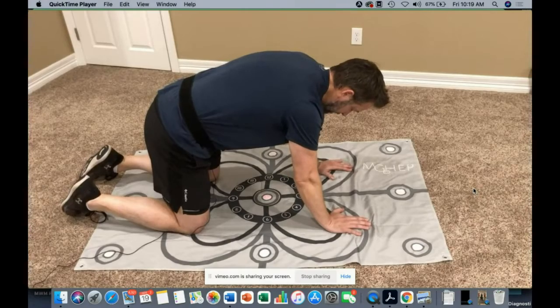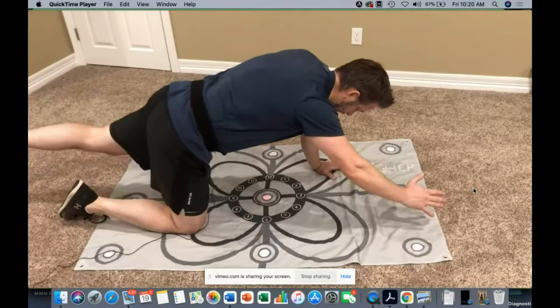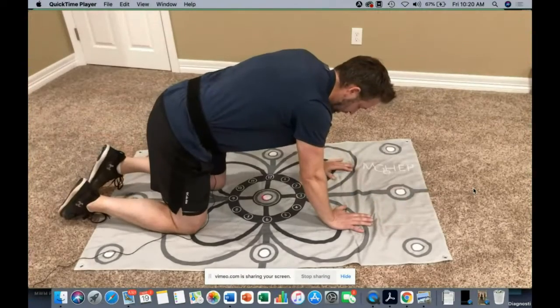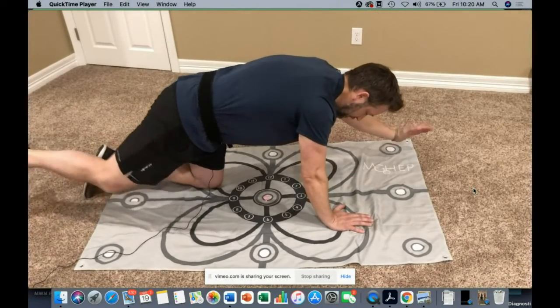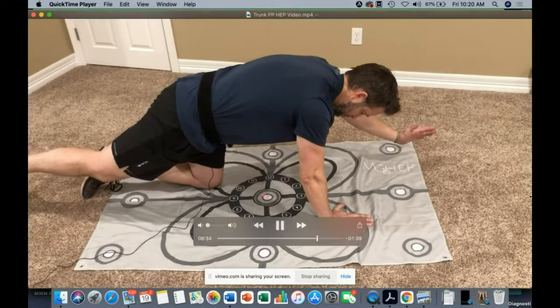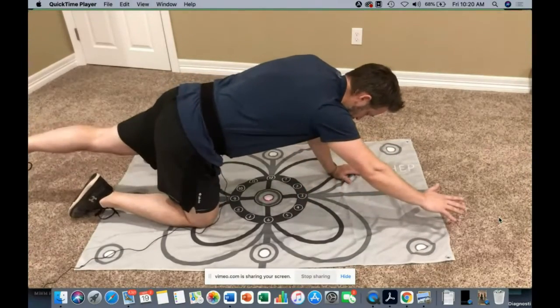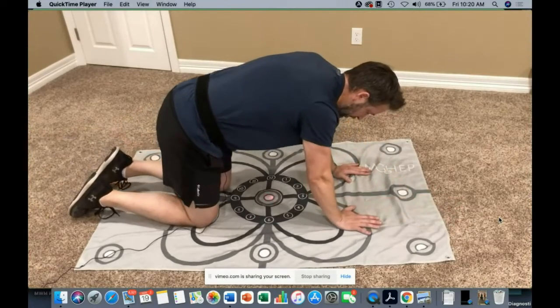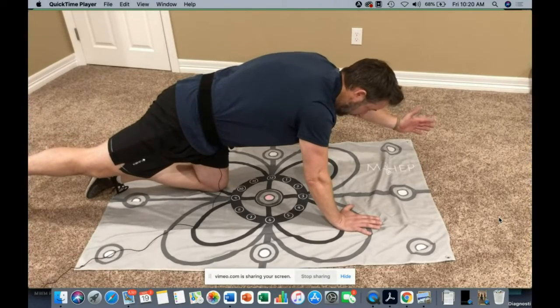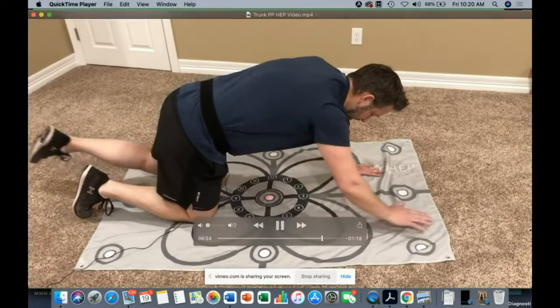But they could be under the drop target instead of the flag. This is the flag example, but the drop target can be great. Having them be able to move without moving the laser can be a great place to start. Maybe adding some movement of the limbs on top of that can be another additive, or starting to move the laser off the center of the target is what I'm going to work through with this one. And of course, again, you can have them go through certain numbers on the target. You can give them math to go along with that for some cognitive overlay. It can be a nice additive for engagement and motivation for your patient while they're doing this activity.